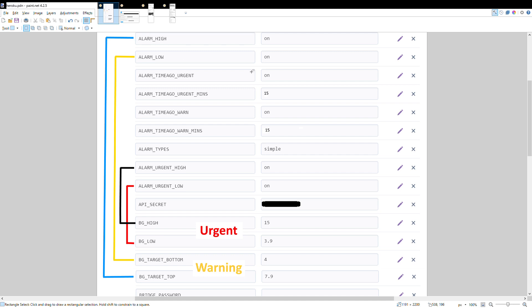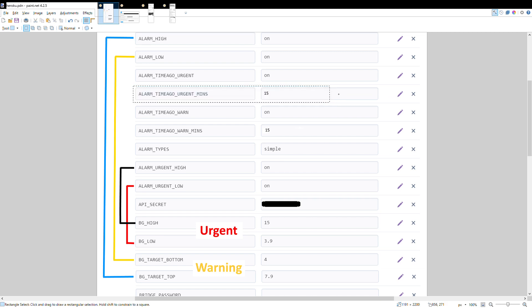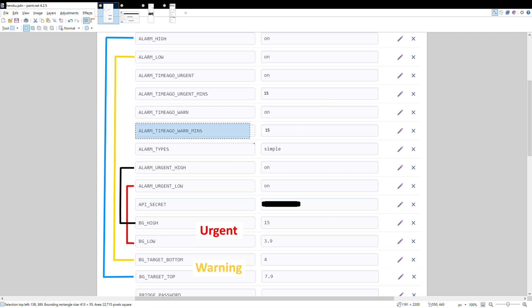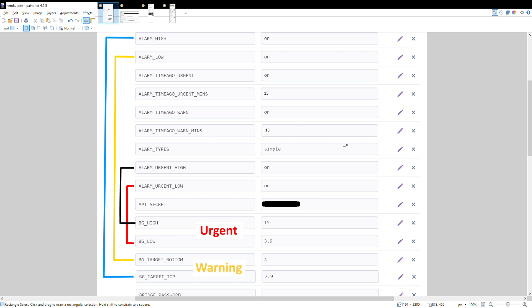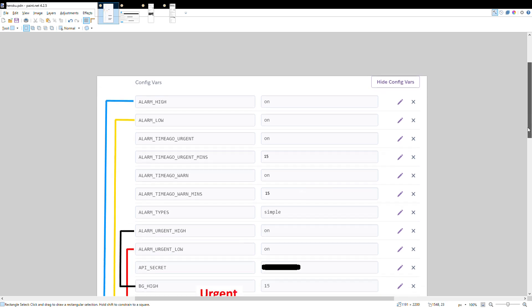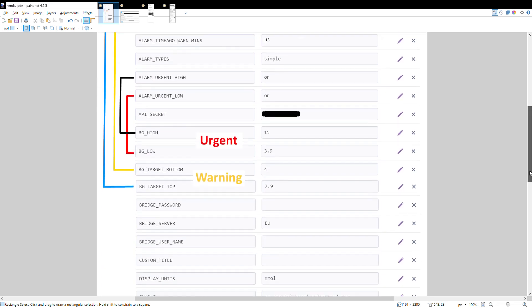The logic isn't very clear but if in doubt just turn everything on. Another setting is alarm time ago urgent mins: when you're outside the urgent high or low, it will wait 15 minutes then trigger an alert, then wait another 15 minutes and trigger again — so every 15 minutes constantly. The same applies to alarm time ago warn mins. You can change these numbers to whatever you want — maybe 20 minutes, or sooner. It's personal preference.